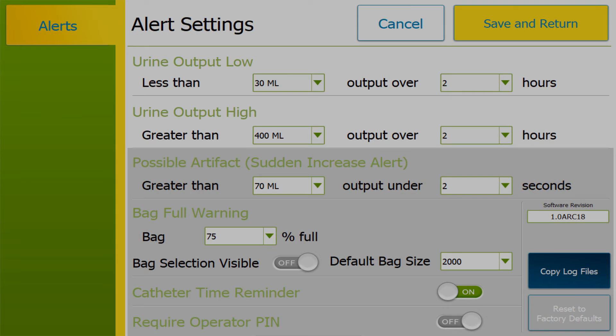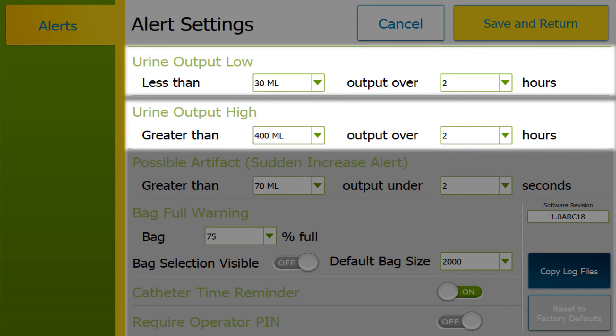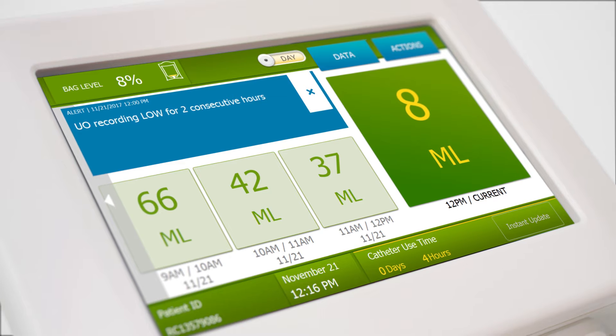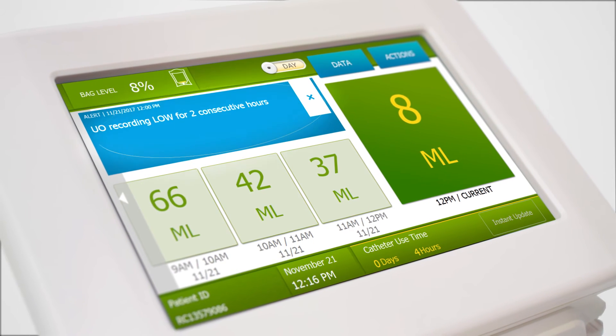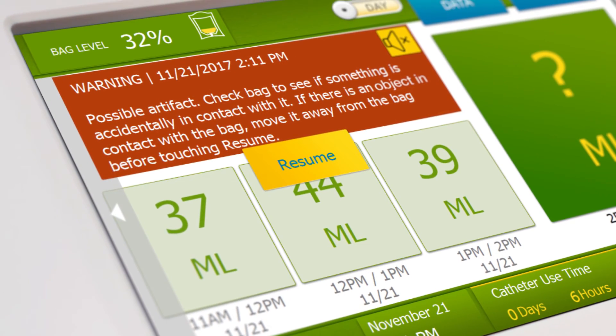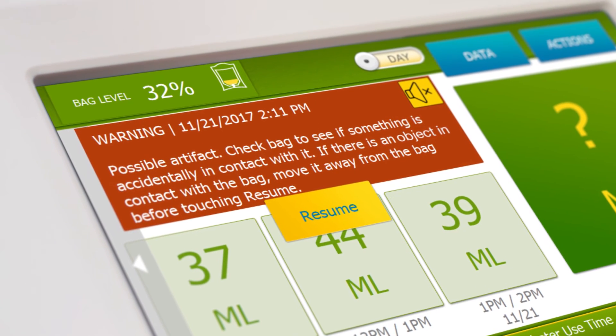To keep close track of abnormal urinary output, you can choose a default setting to monitor low or high urine output readings, or the settings can be easily adjusted for an individual patient. Sensica UO will generate a silent alert in a blue box when these conditions have been met. However, any alerts that require action to ensure accurate UO monitoring will appear in red and have a chirping sound.